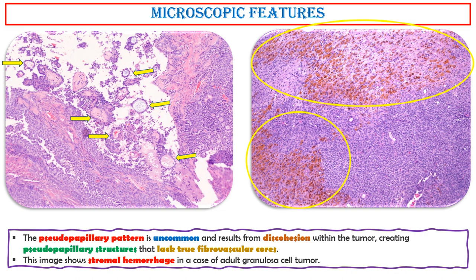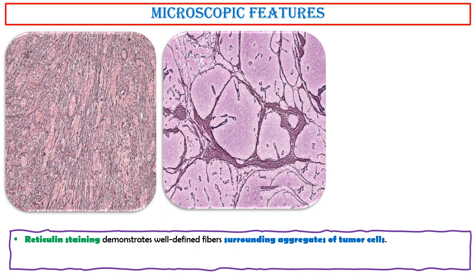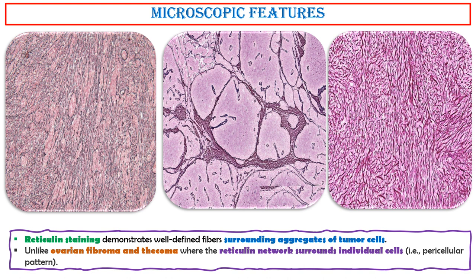This image shows stromal hemorrhage in a case of adult granulosa cell tumor. Reticulin staining demonstrates well-defined fibers surrounding aggregates of tumor cells. Unlike ovarian fibroma and thecoma, where the reticulin network surrounds individual cells in a pericellular pattern, here the fibers surround cell aggregates.